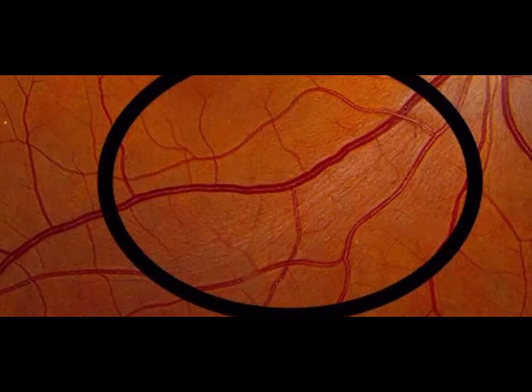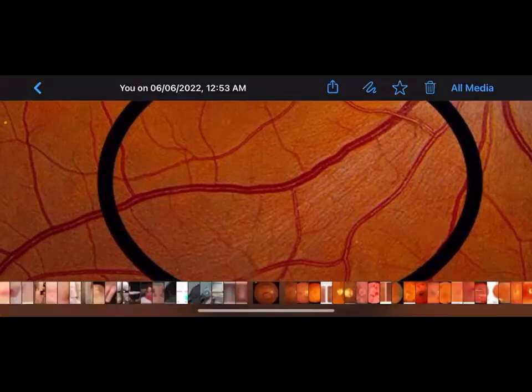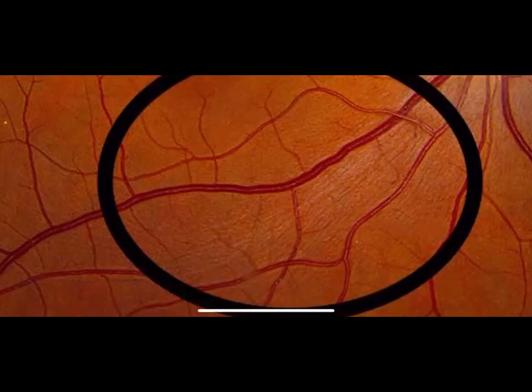And here, by the way, if the patient has any refractive error, despite you adjusting the focus, you will not be able to see clearly. So make sure that if you do not see a clear retinal vein or retinal artery, try to adjust the focus here. Either add some positive focus or some negative focus, until you can see the artery very clear and sharp. Now you will have corrected your focus and the patient's focus. Then you will follow any retinal artery.